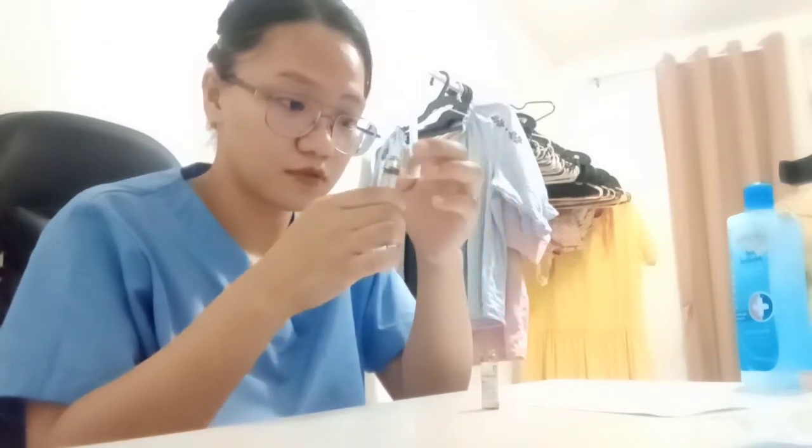Carefully, do not touch the rim so that there would be no contamination. Next is to expel the excess air from the syringe. So here is the 1 cc.